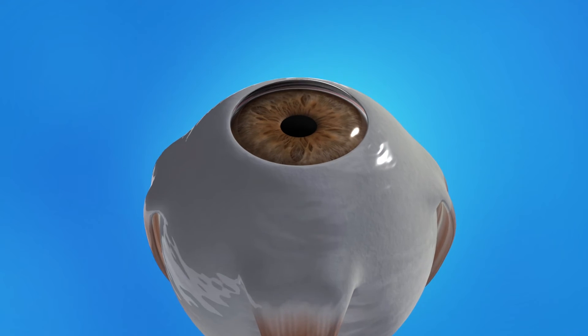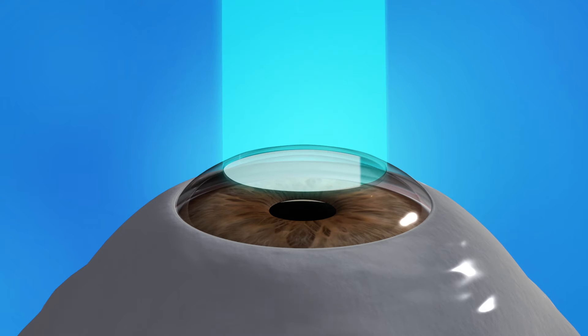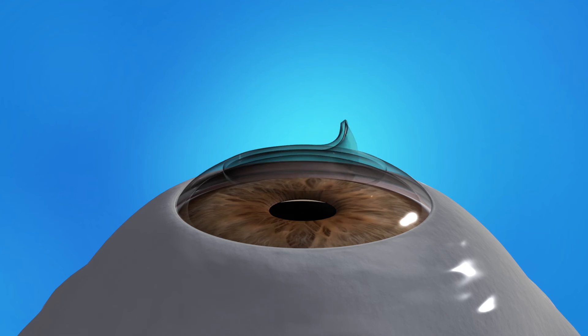With all laser LASIK, your surgeon uses a laser to create a very thin flap of tissue in the top layers of the cornea. This corneal flap is folded back. Your surgeon then uses another type of laser to remove a precise amount of corneal tissue. Afterward, the flap is laid back in its original position where it heals naturally in place.